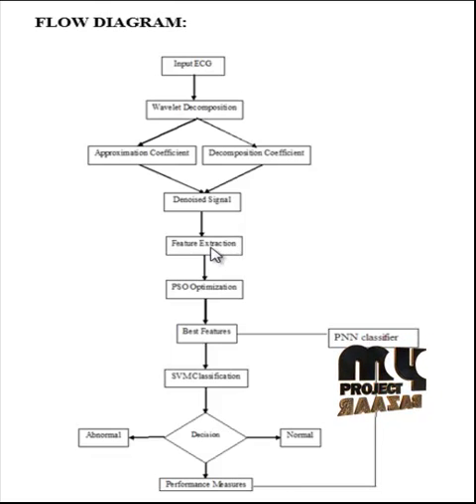After that, the features were extracted based on the statistical parameters from the ECG signal. For the extraction of the features, mean, moment, skewness, standard deviation, variance, and kurtosis were all calculated. Along with these features, the RR interval of the input denoised ECG signal is also measured. From the extracted features, best features were selected using PSO optimization process.